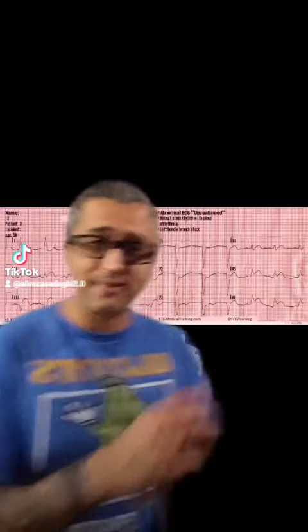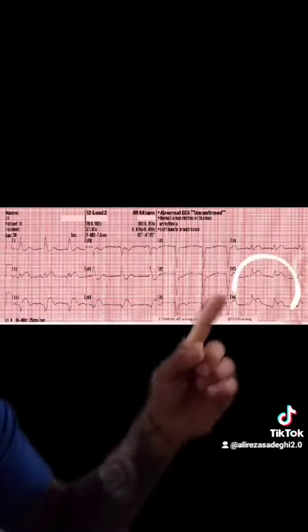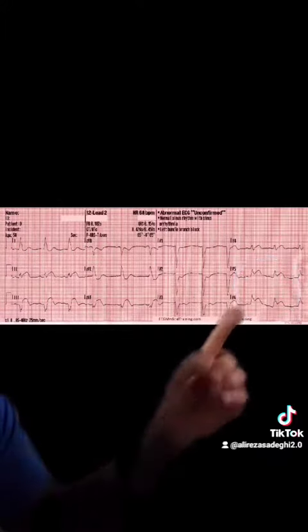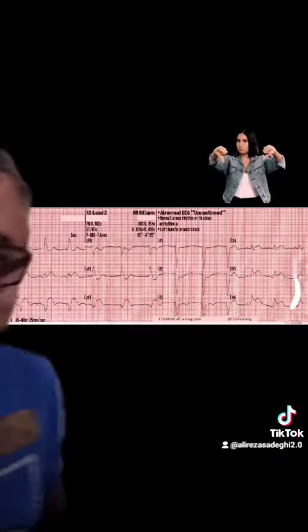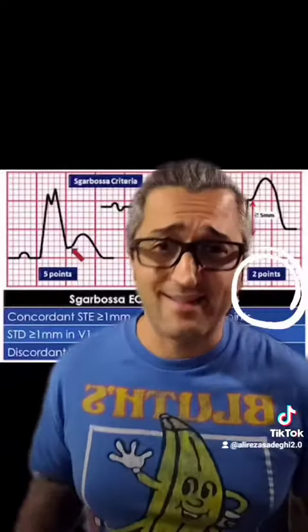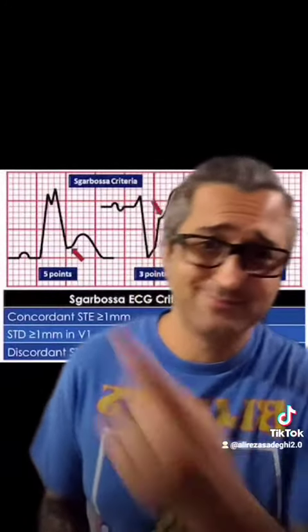Now that we know this, let's look at some examples. Here's example number one. I have a left bundle branch block, and all I need to see is this right over here: I have a QRS complex and a T wave and an ST segment that are going the same direction. Abnormal. Is that Sgarbossa? Yes, it is.